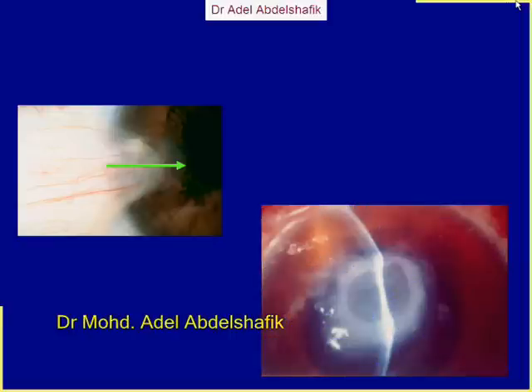So if you get something like a pterygium, you can measure how many millimeters this pterygium is getting into the limbus. So for follow-up, you can tell exactly if it is stable or progressive. If you have a corneal ulcer, you can measure whatever meridian you want and write it down. So for follow-up, you can say this ulcer is improving or this ulcer is getting worse.